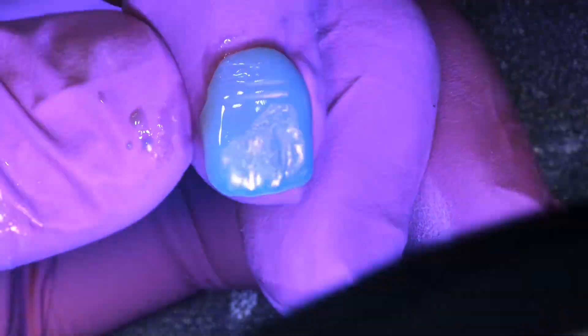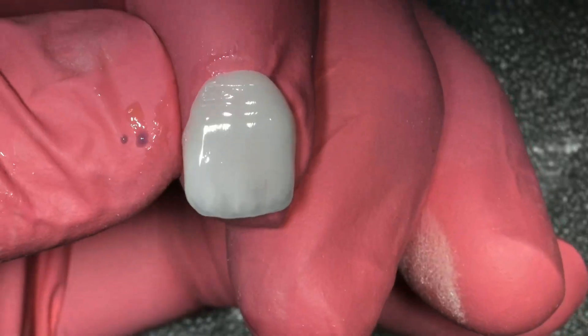We went ahead and put these in on the same day she came in, and you can see the final result. She is so happy with her new smile. These are just printed veneers — all eight of those veneers were printed in about 20 minutes and delivered, all in the same three-hour appointment. Absolutely incredible, guys. I hope you enjoy the power of 3D printing in your offices, and reach out if you have any questions — I'd love to help you with your printing journey.